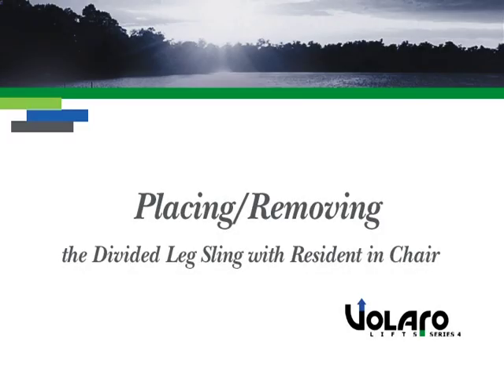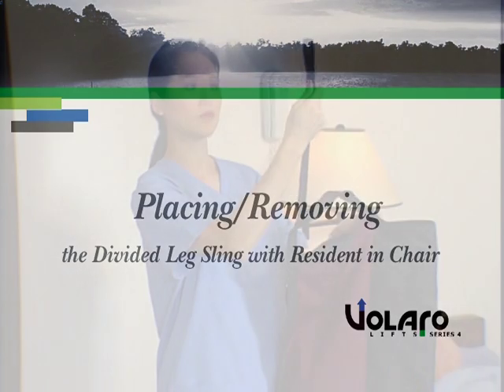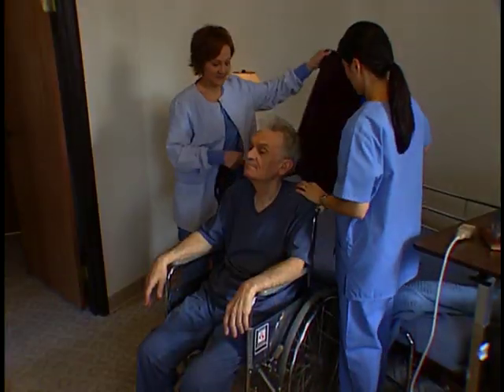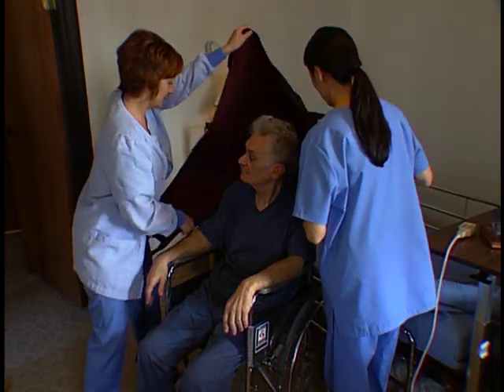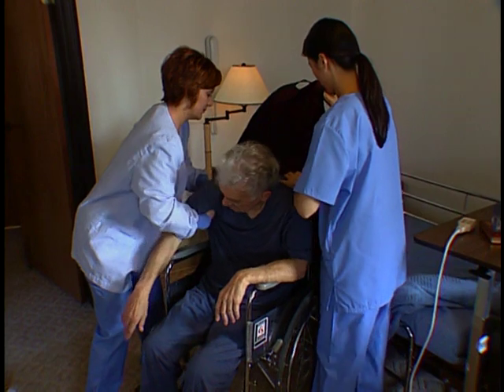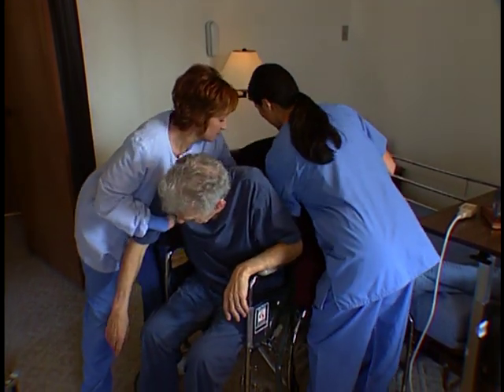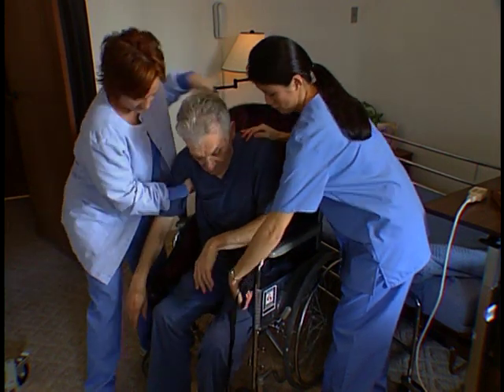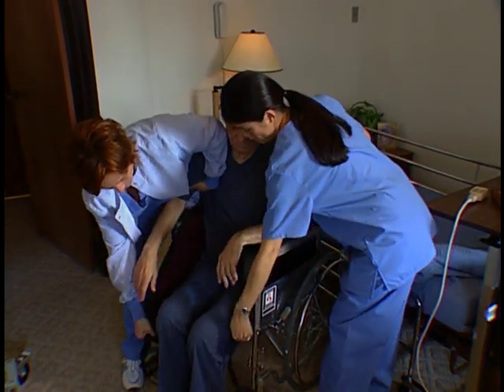Instructions for placing and removing the divided leg sling with resident in chair. After completing your safety and sizing checks, lean the person slightly forward to get clearance between the back of the person and the back of the chair. With the handles facing the caregiver, slide the U-shaped portion of the sling down to the person's tailbone. The center handle should be in the middle of the resident's back.